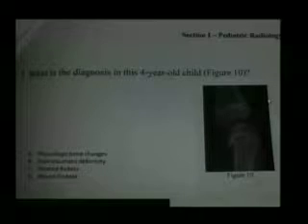Blount disease. This is pathognomonic, Aunt Minnie, for Blount's disease. We used to believe Blount's disease was an AVN, now they don't think it is. They think it's due to repetitive trauma. And the varus configuration can get worse and worse. This is not physiologic. Sometimes you can get little metaphyseal beaking, but you're not going to get this deformity, this varus configuration. It's not from previous trauma. Treated rickets, usually they're going to have bow legs, bowed bones, they're going to be osteopenic. The growth plates are normal. This is Blount's disease.